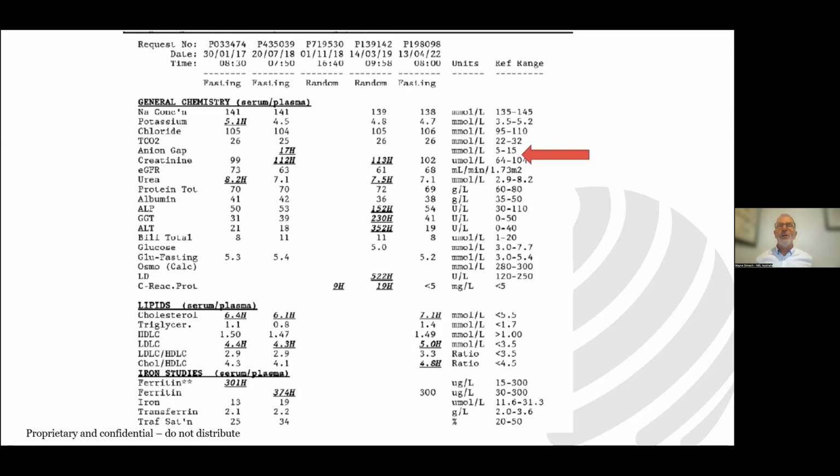In a normal human, we have a reference range. If we test those samples over time, we can see a rise and fall of some of these analytes, and when the analytes are unexpectedly high, we are able to highlight those to the clinician.